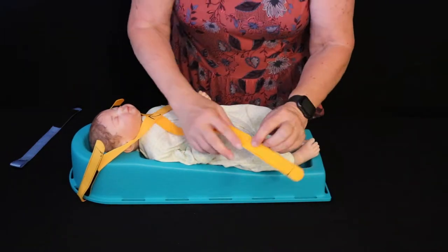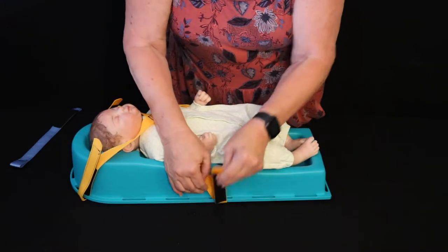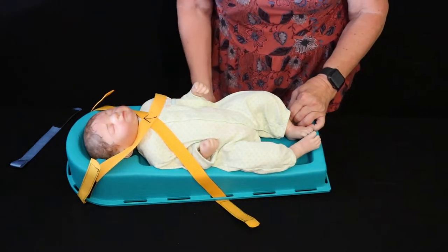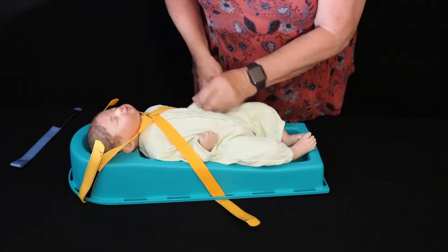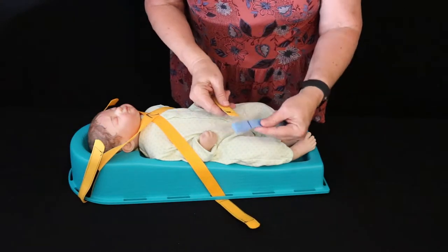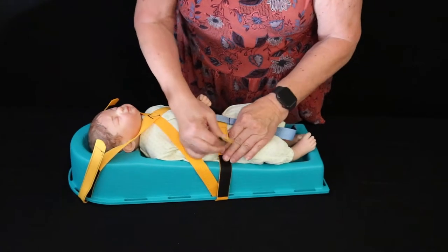Then you'll place the additional straps — the leg straps — so that the strapping system will cross the baby's hips. Securing the arms in is a good idea, but not mandatory. Because we have the crotch slot, we're going to additionally put this strap in before we secure the hip straps.